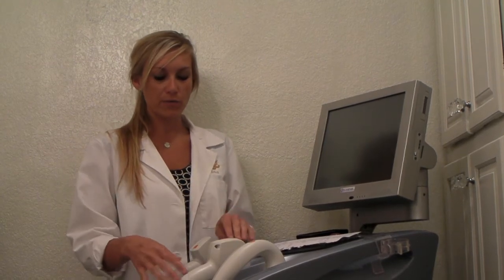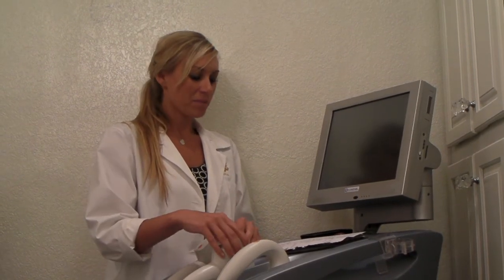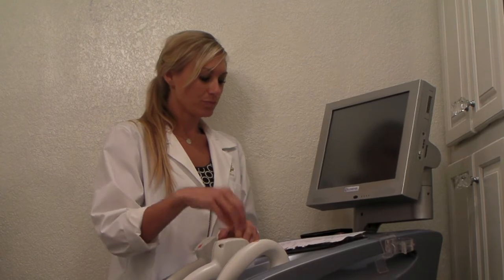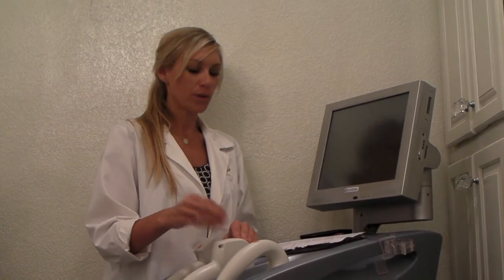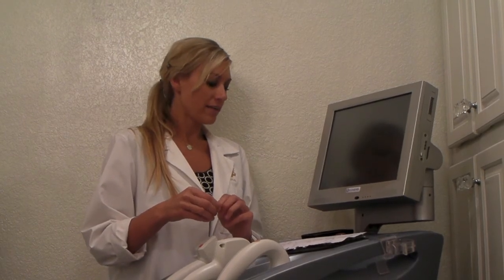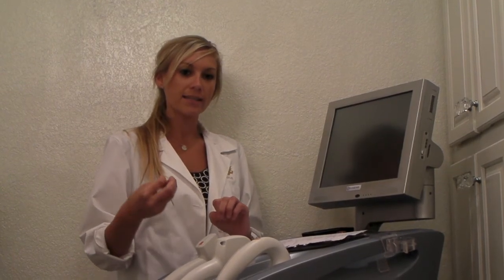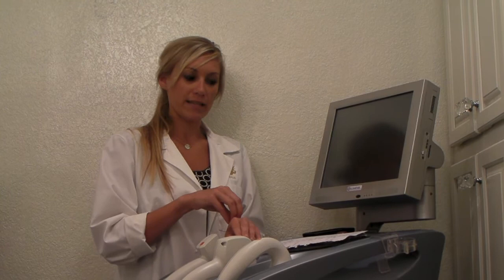Whenever someone comes in for hair removal, depending on what area of the body the hair removal is taken away, we'll recommend probably 6 to 8 treatments. Whenever someone comes in and they have their first initial treatment, they should expect a 10 to 15% reduction. And after that, they'll see the perifollicular edema, which is what we want. It means that there's an inflammatory process because the hair at the root is actually killed.